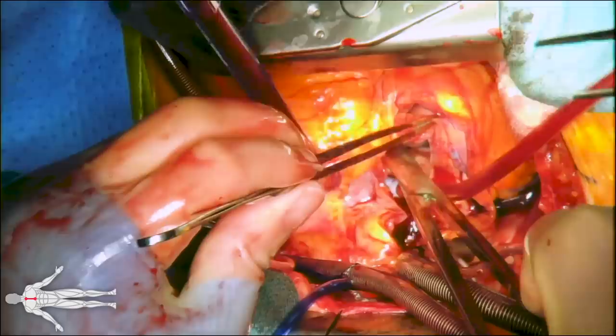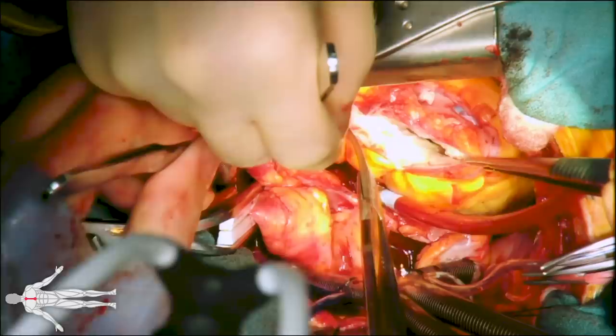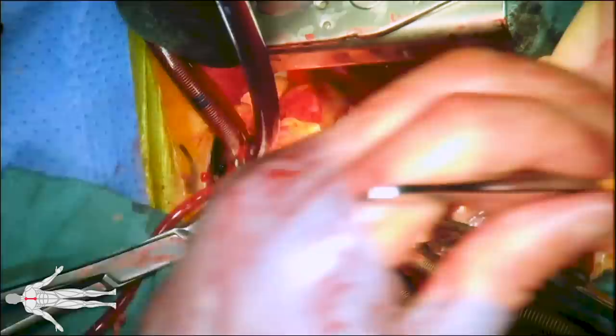The incision is extended superiorly to the dome of the left atrium to meet the superior extension of the right atrial incision. Further dissection is then performed until the left atrial excision is complete and the recipient heart is pulled off the field. A portion of the remaining right atrium is then removed, leaving a cuff of right atrium on the recipient's inferior vena cava.